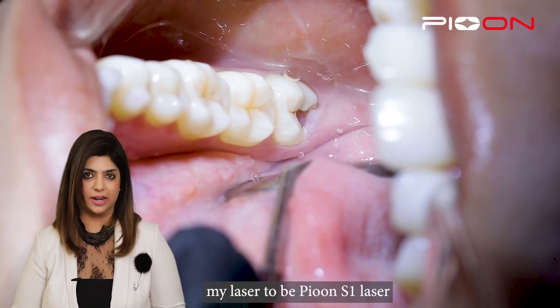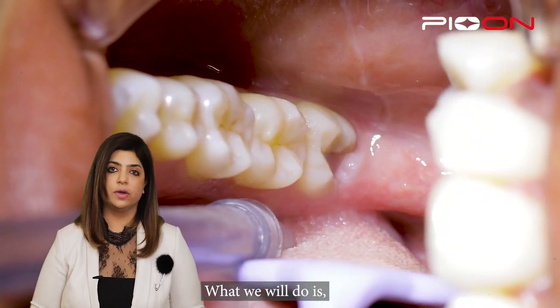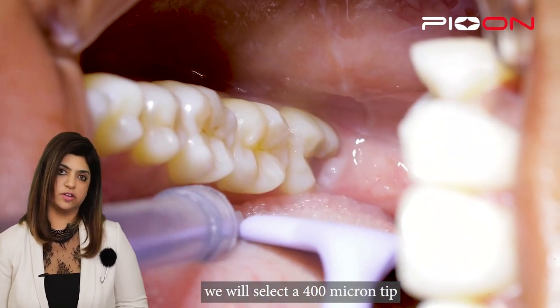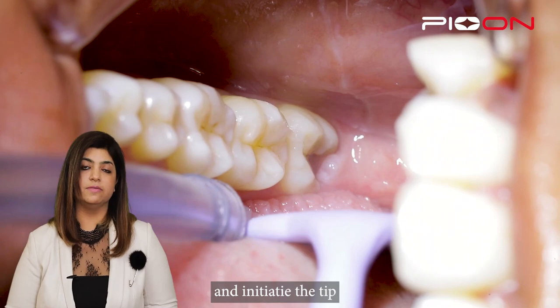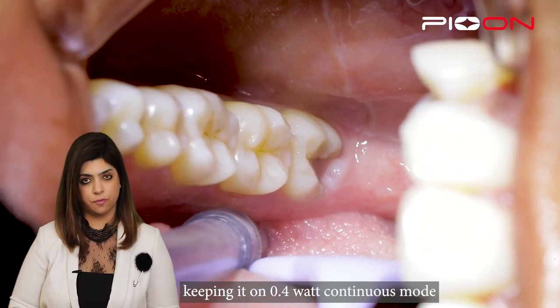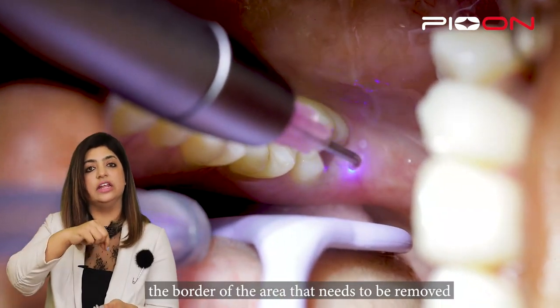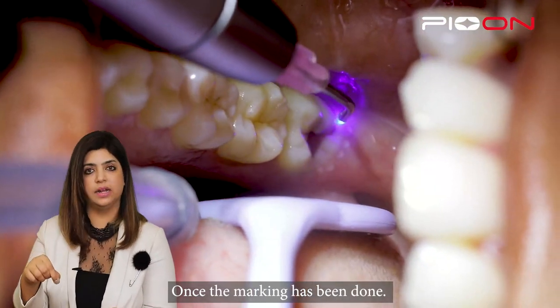Before we start, I have selected my laser to be the Pioon S1 laser at a wavelength of 450. We will select a 400 micron tip, which is a surgical tip. We will initiate the tip and then, keeping it on 0.4 watts, I will give a marking around the area which needs to be removed.